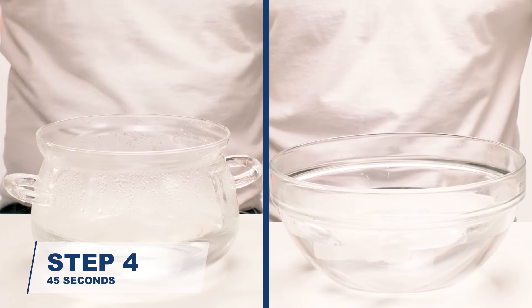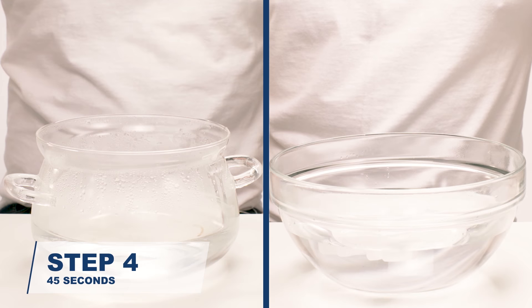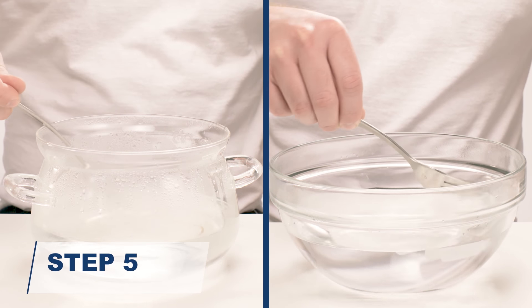Place the guard and forming tray face down in the hot water for 45 seconds. Remove the tray with a metal fork. Quickly rinse under cool tap water for one second.